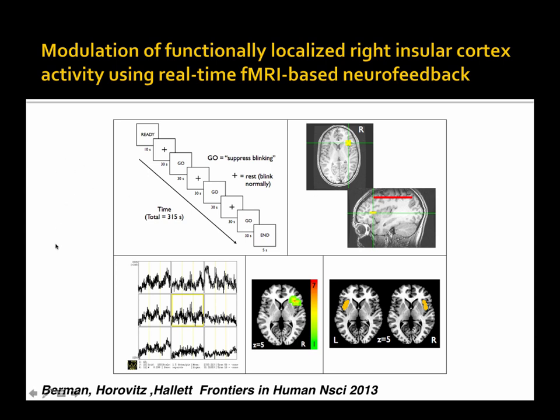But to start off, the IRB suggested that we start with healthy volunteers, so this is what we did. To find out the area, we used blink suppression because these were healthy volunteers. So if you keep your eyes open for a minute, once I let you blink, you will blink a lot more, right?